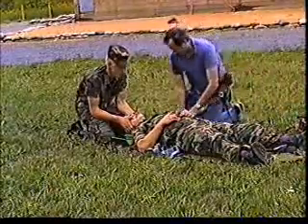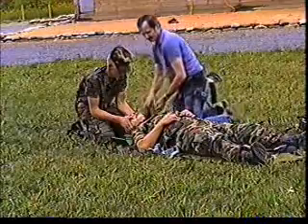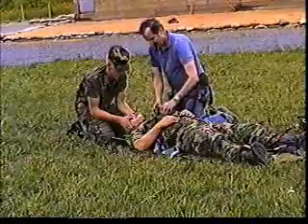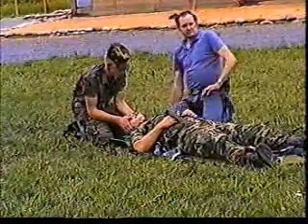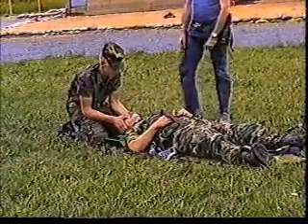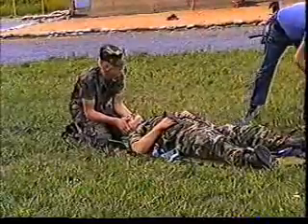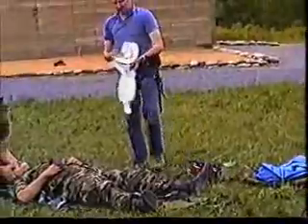So let's start with the shoulder strap. Always start at the top and work your way down. Everything is color-coded. See there? If I was an EMT student, I'd have been in real deep trouble because I almost immobilized him without a cervical collar. Hang on. Actual event here. Okay, we already determined ahead of time that the regular size collar for him fits properly.